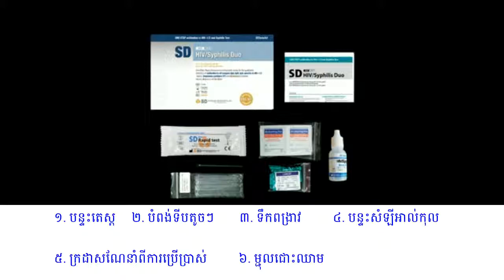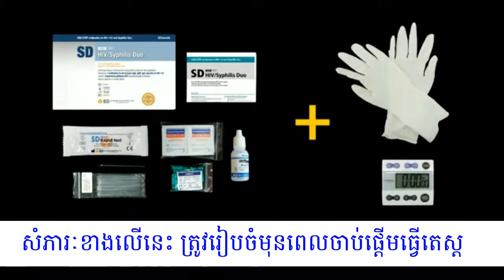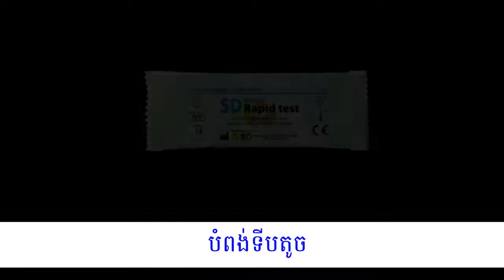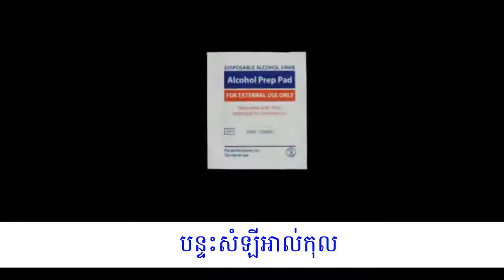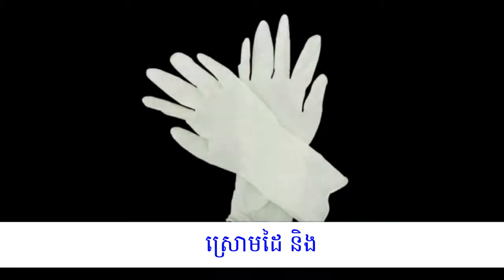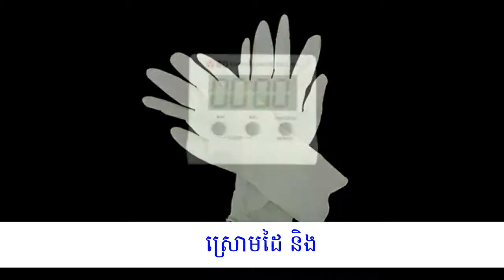The materials included in the kit are a test pouch, buffer, package insert, lancets, and capillary pipettes. Alcohol swabs are provided if required. These materials should be prepared before starting the test: unopened test pouch, disposable capillary pipette, unopened alcohol swab, unopened lancet, assay diluent. New disposable gloves and a timer are not provided but are necessary.